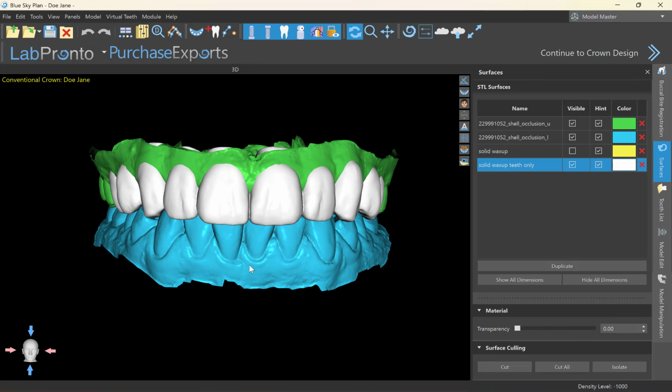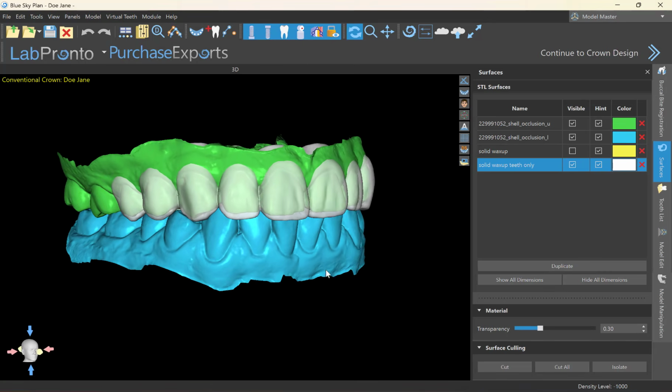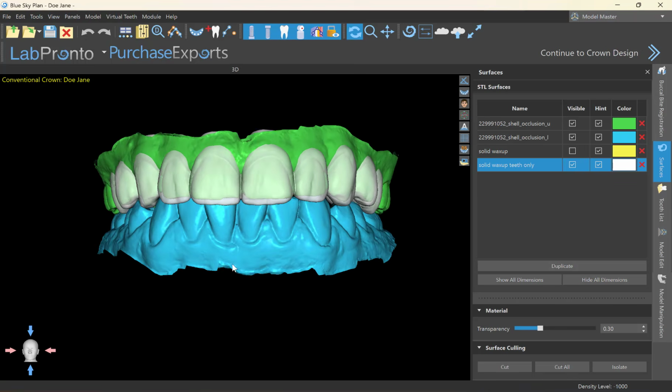But obviously, I hope this goes without saying, if you're doing this, you need to account for smile design, picks, finding the right lengths of teeth, all of that kind of stuff. All right. Again, this is a non-clinical case, so I'm not doing that. But these teeth were short, so I just kind of did a quick and dirty wax up of where I thought the teeth would look good.